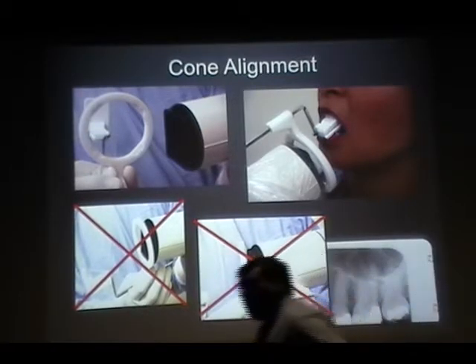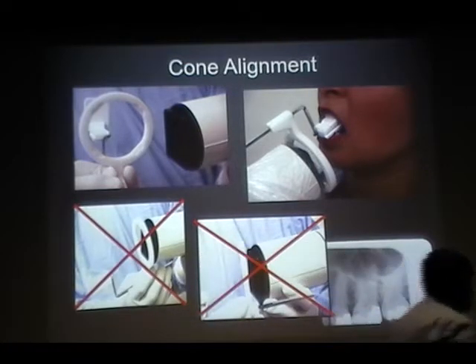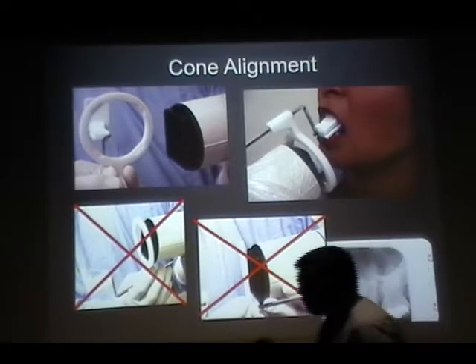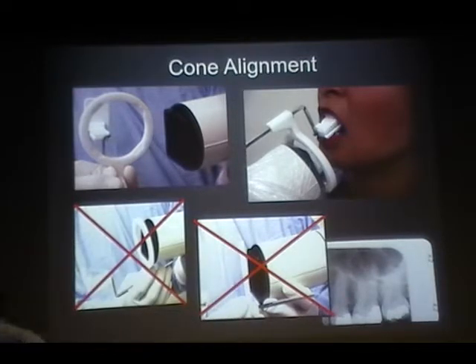Yes. And in that one, is there too much alveolar bone? You don't need that much, or? No, we don't. How far up do you need? 2 millimeters. Okay, all right. So why I am hung up on 2 millimeters is, is there any loss of lamina dura? Is there any pathology that you are seeing there beyond the apex of 2?